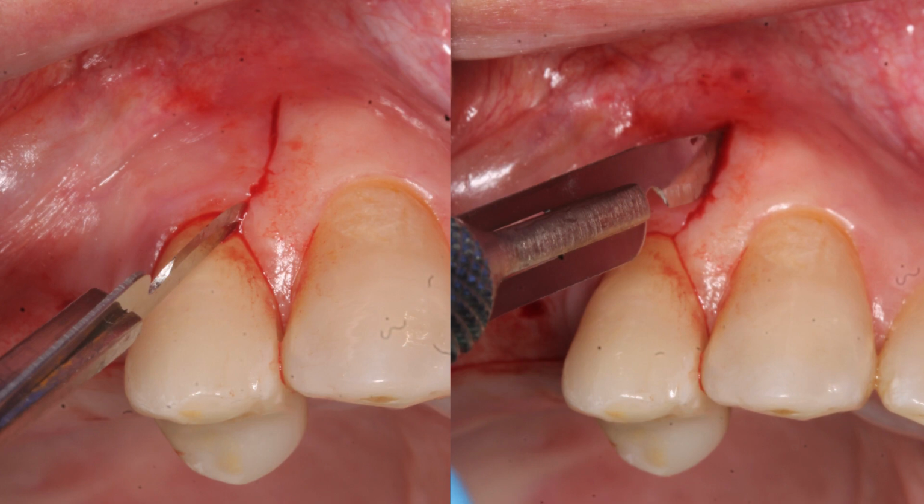Notice on the left of the screen, I have the blade pointed, the sharp side pointed away from the tooth. That's actually how I start. In other words, I like to get the very sharp point of this 15C blade to touch the crestal bone and then feel it, because I really don't know where it is. And then once I go through that, then I turn the blade completely 180. So now the sharp end of the blade is pointing towards the bone and go straight down. So I do that in 2 steps. I feel that that's a safeguard, and that's the way we can actually do things much more predictably.